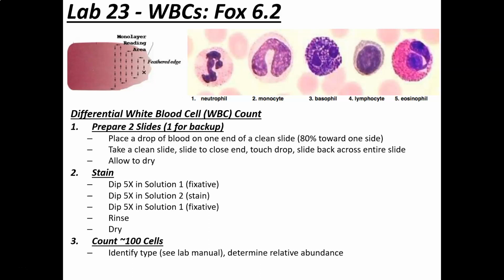And neutrophils have a couple characteristics to look at. One, they tend to be the middle size. I'll go over that in a second, so I might as well do it now. So here's the middle size. I think of the neutrophils like the size of a nickel. Basophils are about the same size, about the size of a nickel. Eosinophils, about the size of a nickel. So all the ones that end in phil are all the average middle size.